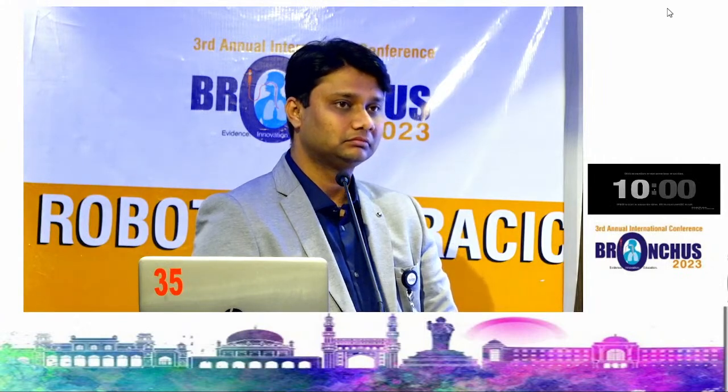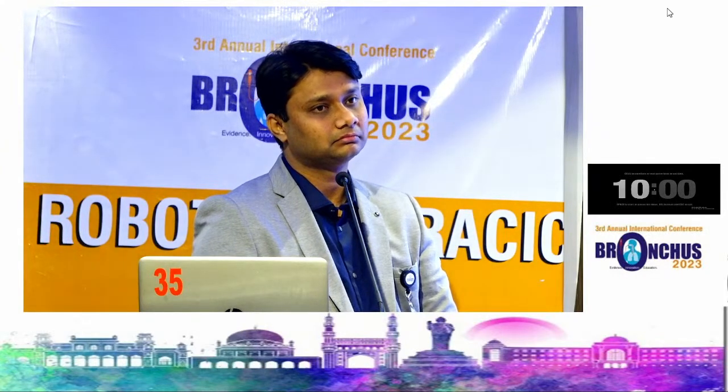I will add one thing. My strategy is that you identify all the structures, loop them and clip them. Don't take an irreversible step at the initial stage. If you are 100% sure that this is the upper lobar vessel only, not the middle lobar vessel, then fire the staples. If there is any doubt, loop it and keep it aside, start dissecting the artery, the bronchus, and the posterior ascending artery. When everything is dissected out, just go on firing the staples. That saves a lot of time putting the stapler in and out.